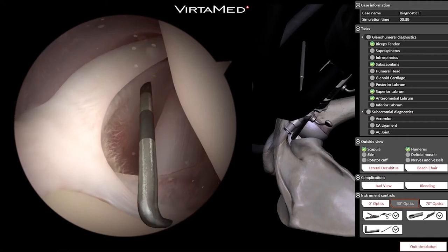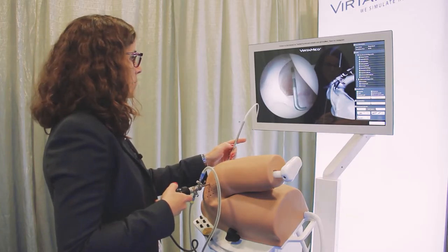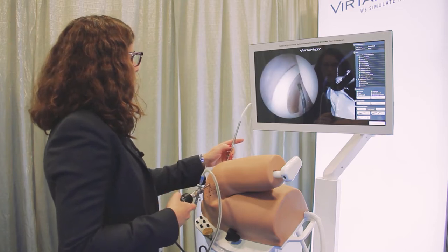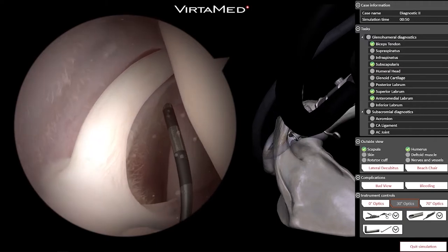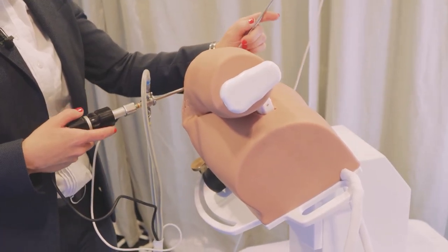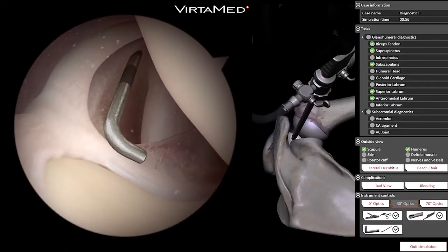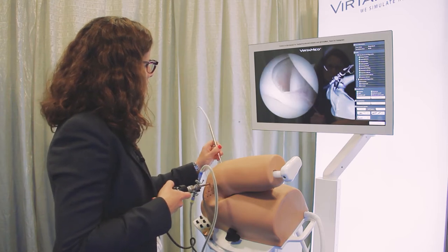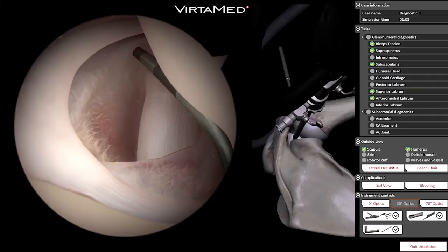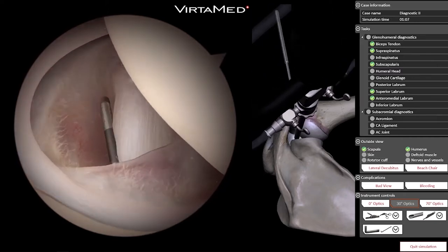I have the probe in the anterior portal, which is situated between the biceps and the subscap. We can see the long head of the biceps at the front of the screen, and the back of the probe is touching the biceps. The humeral head is to my right, and the glenoid is on the bottom of the screen. I'm looking at the anterior inferior aspect of the shoulder — this is the middle glenohumeral ligament sitting on top of the subscapularis tendon.